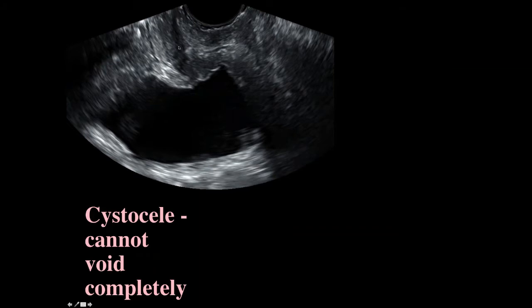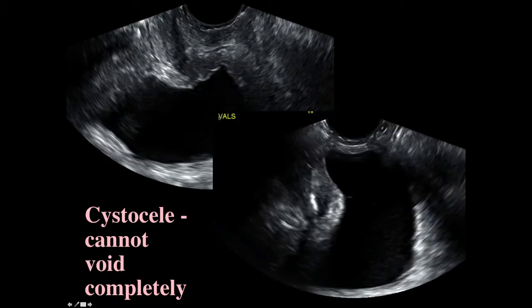So here is a cystocele without even Valsalva, and this bladder is starting to migrate into the place where the vagina is supposed to be. And when she Valsalvas, look at what happens. The whole thing just rotates, and the bladder basically descends down to the probe. So it actually comes almost right out, and so clearly this part of the bladder can't possibly be empty.